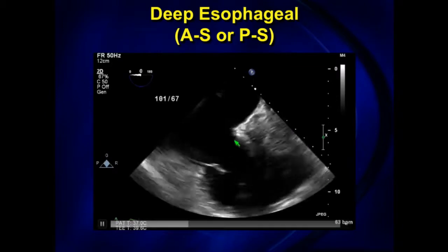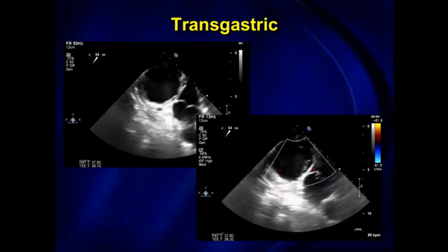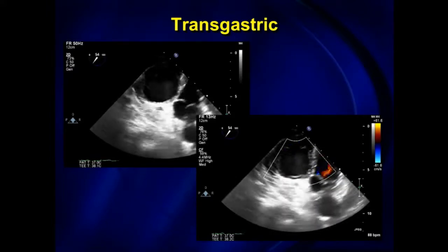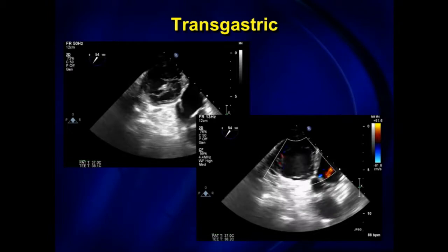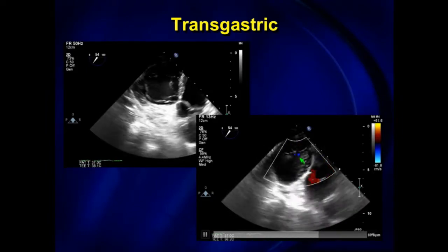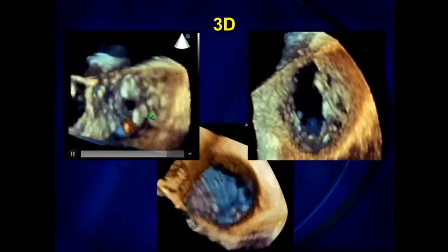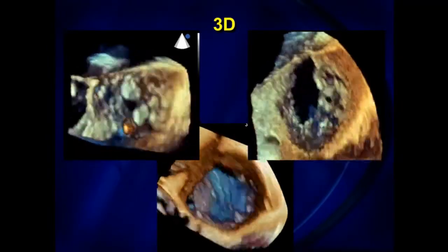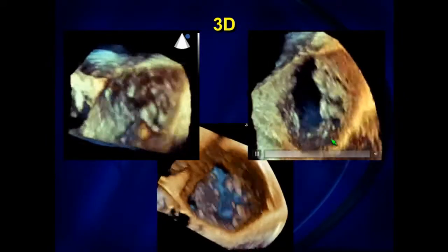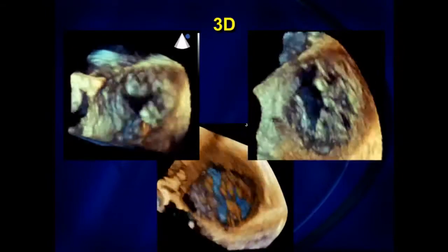Here you see the patient has a huge coronary sinus. From this view you'll see septal-anterior or septal-posterior leaflets depending on how deep you go. For these procedures, the transgastric view is really critical. We've gotten away from that with mitral interventions, but because the tricuspid valve is difficult to image, this view is critical to see leaflet identification, mobility, coaptation, and to identify where the tricuspid regurgitation is coming from. 3D can be quite variable — if you have somewhat thickened leaflets you'll get good reflections and a nice 3D view. More often, because the leaflets are thin, you get a lot of dropout and a moth-eaten appearance, though sometimes it's good enough to identify leaflets. That's why the transgastric view is so important.